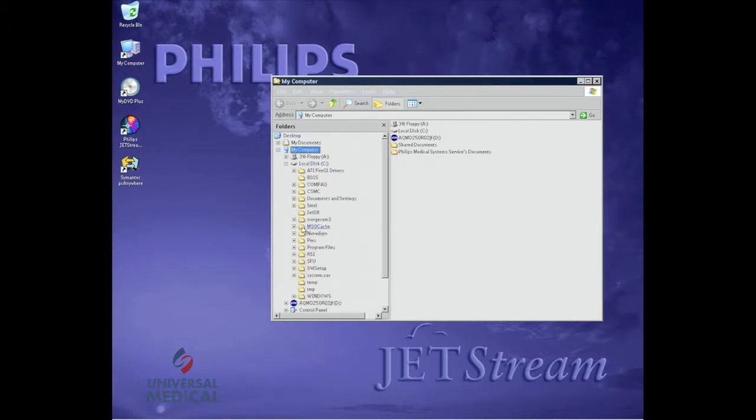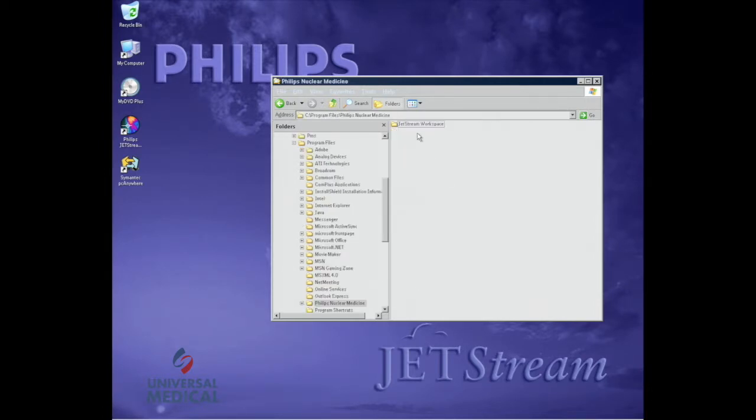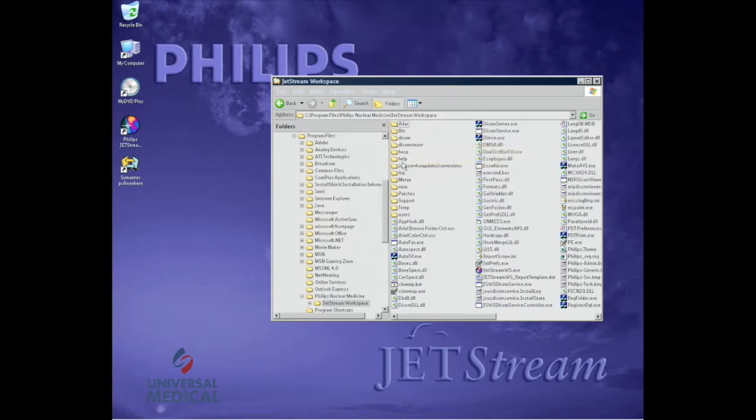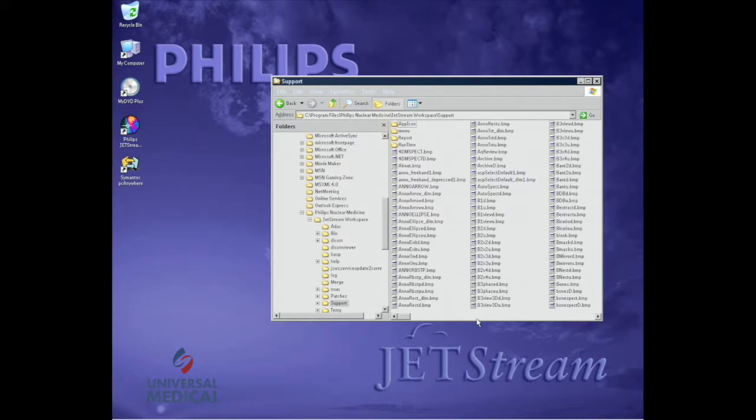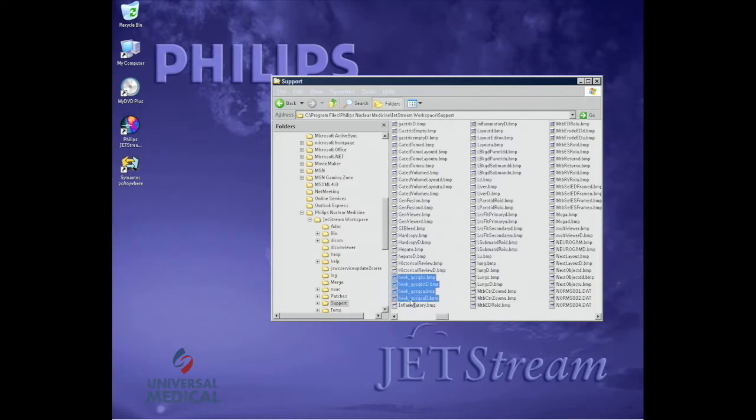So what I'm going to do is I open my computer, go into my C drive, go to my program files, go to Philips Nuclear Medicine, JetStream WorkSpace, support, and if I look in support, here they are right here. You will see these four icons. If you remember the names when we installed AutoQUANT, one of them was QBS and the other one was QCA.